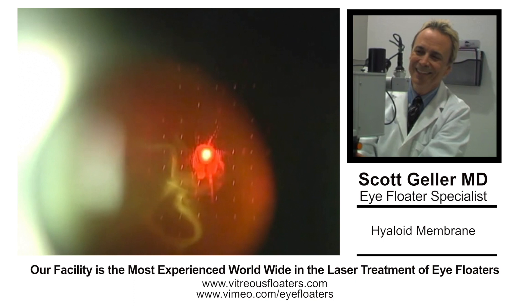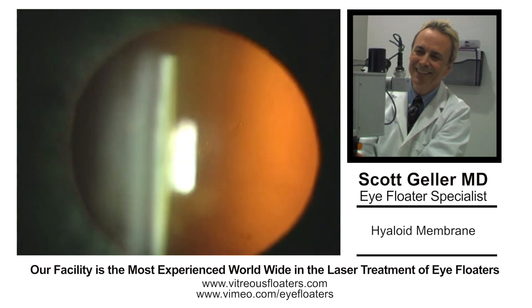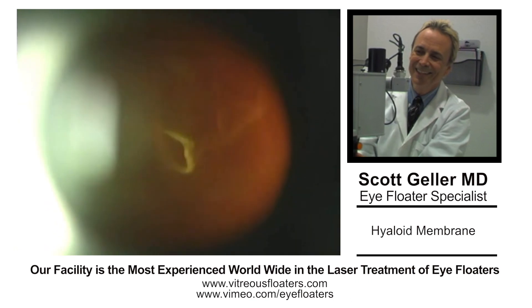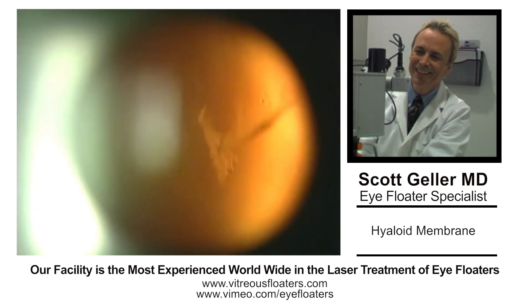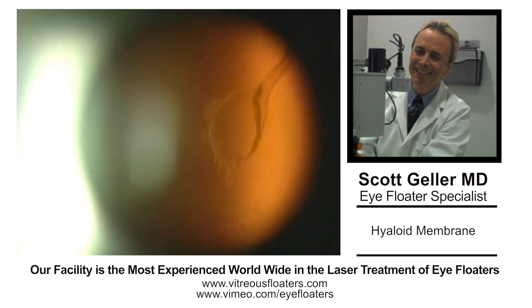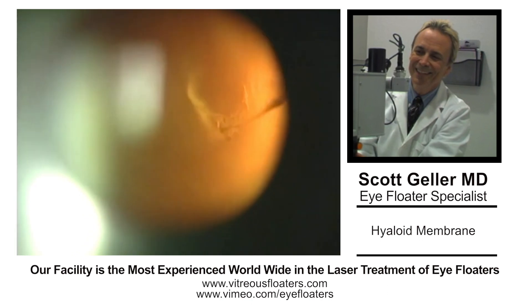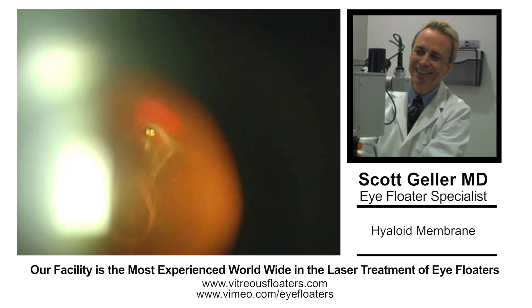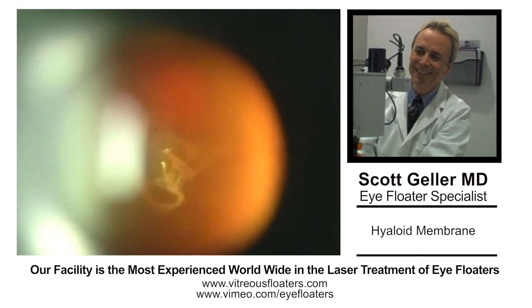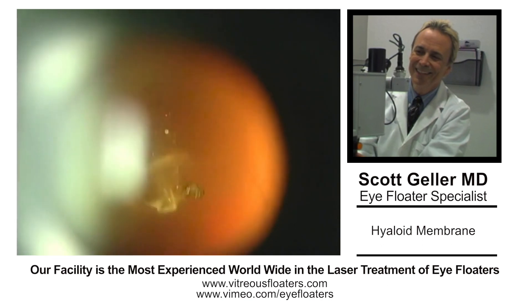This patient had a hyaloid membrane — it's a little different than the average floater. Initially, we always tell the patient that they have a problem. This patient had a very small cataract. Looking into the eye, we're using a CGV contact glass from Lezog and the Lezog microruptor laser, which is the very best on the market, made in Switzerland. There are very few of us worldwide who practice this procedure with this unit, and I find it the best — I've tried them all.